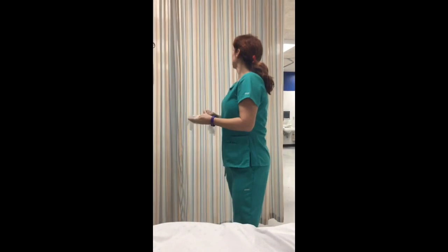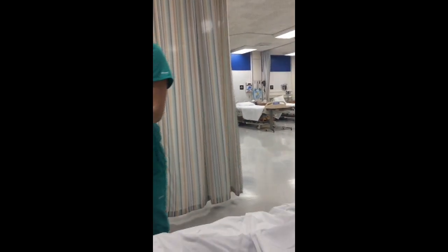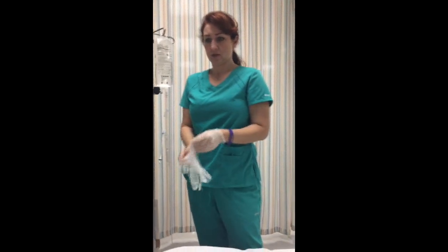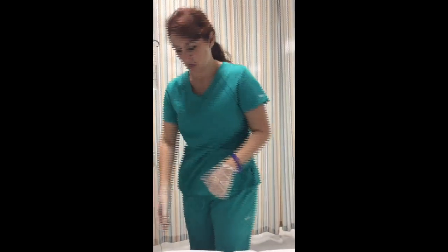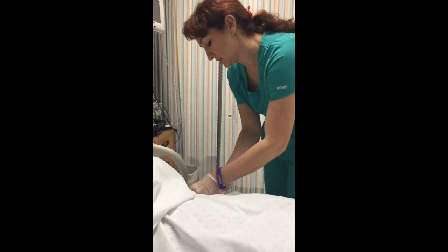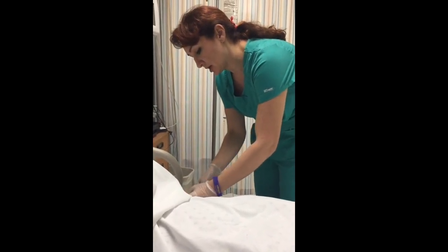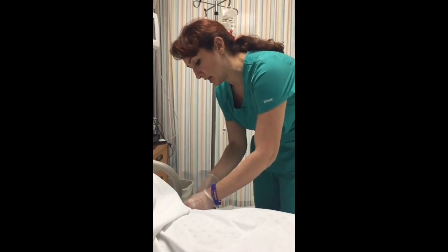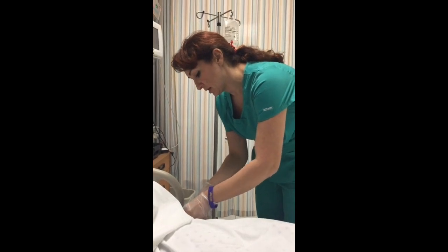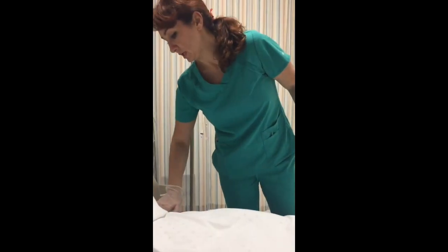I'm going to wash my hands. What is your name? My name is Sarah Jones. And your date of birth? 1/1/1990. I'm checking that with your armband. I'm checking your IV to make sure there's no redness or swelling. It's an 18-gauge — the minimum we can use for blood is a 20-gauge, but we definitely prefer the 18-gauge. Everything's flushing easily; there's no redness, swelling, leaking, or pain at the site.